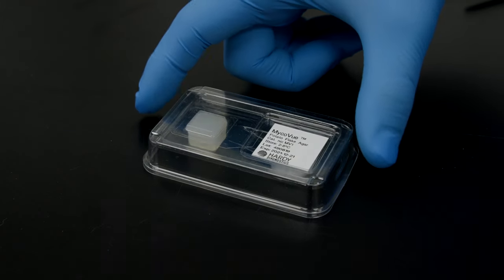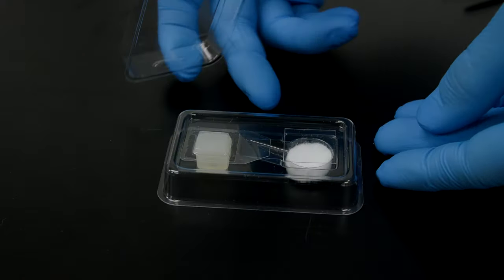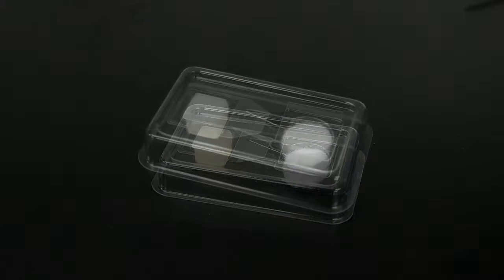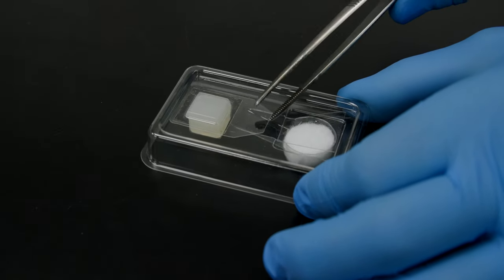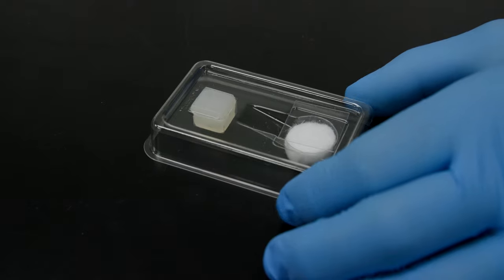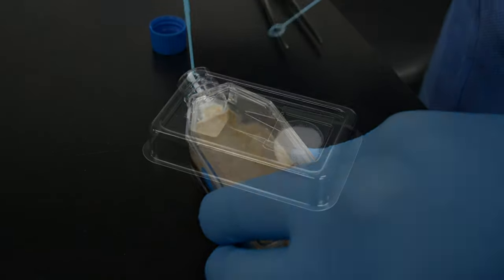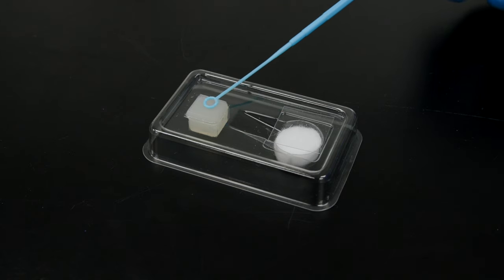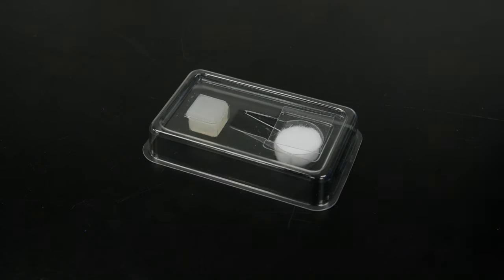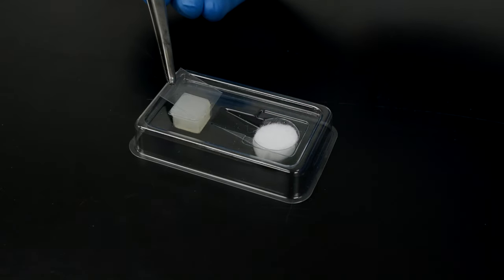Remove the lid from the MicroView device. Carefully peel off the protective tab that covers the culture media, and discard the tab. Inoculate the agar surface with your specimen. Then place the included sterile cover slip onto the inoculated agar surface.